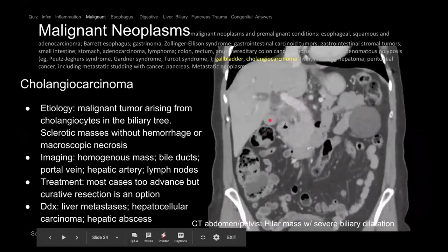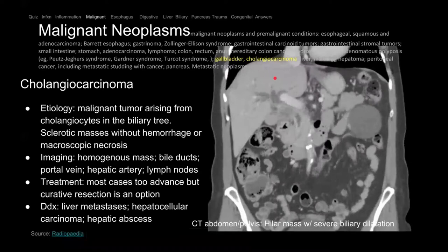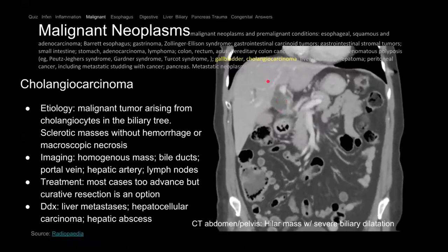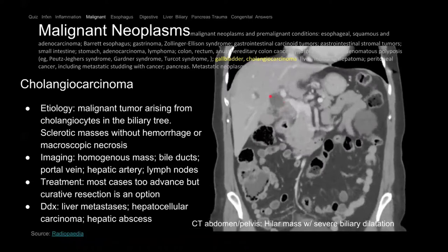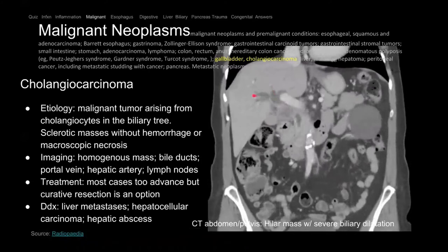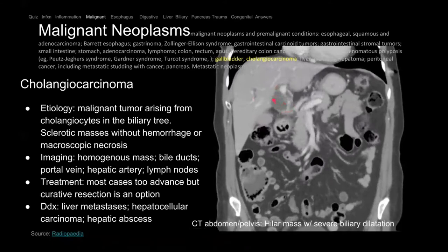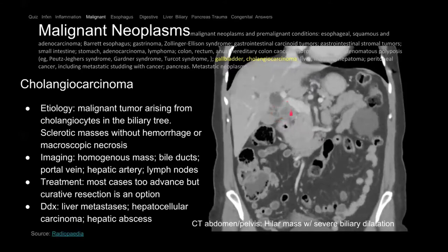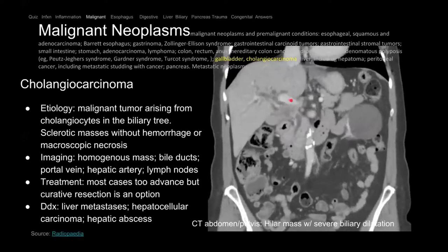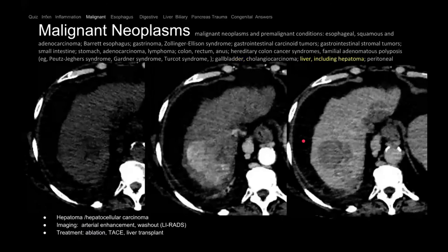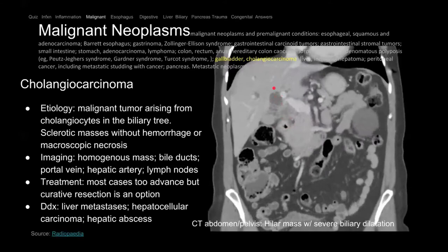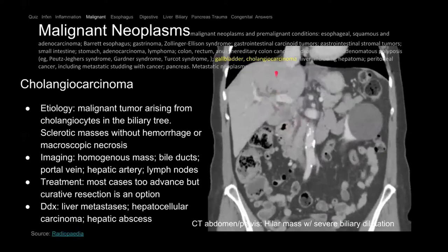This patient came in with high bilirubin and jaundice. CT abdomen and pelvis shows markedly dilated intrahepatic bile ducts and a dilated CBD that tapers down into a mass — cholangiocarcinoma. The portal vein is very close to the mass. This is a Klatskin tumor — cholangiocarcinomas involving the hilum are called Klatskin, but they can also be intrahepatic, peripheral, or intraductal.